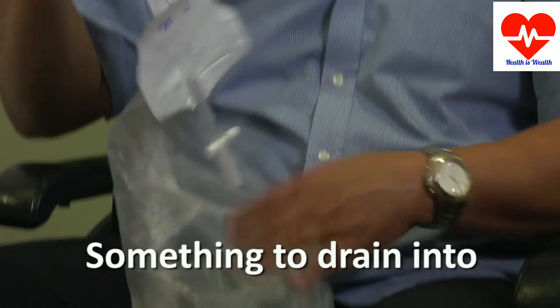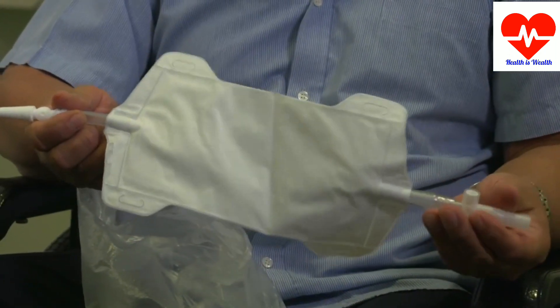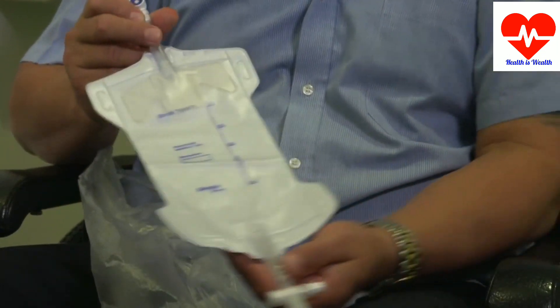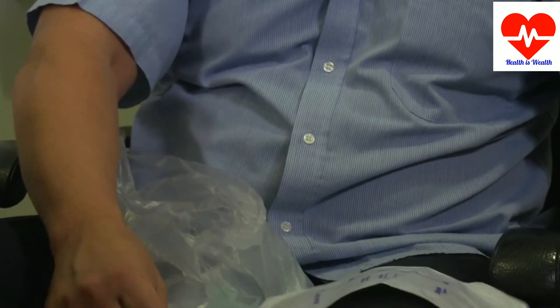And something to drain into. There is no restriction as to what you can use. When in hospital while you're first learning, you usually use a catheter bag. This helps to keep the urine contained. It's easy to use when you're in bed and it helps to measure the urine output. You can also use a bottle or extension tubing that drains straight into the loo.